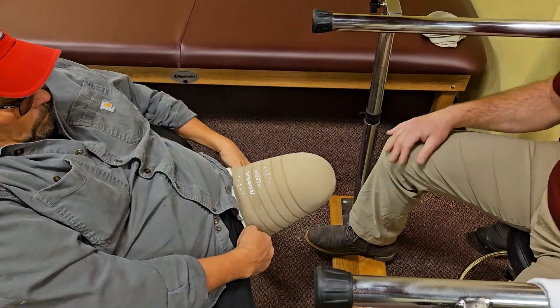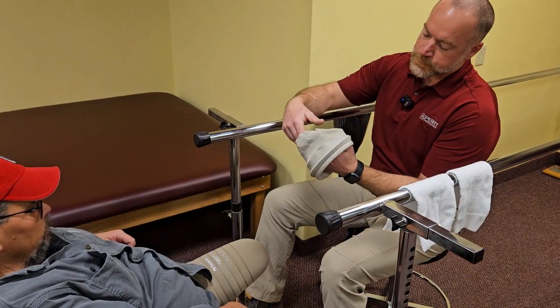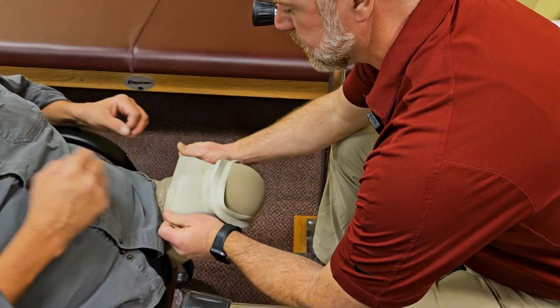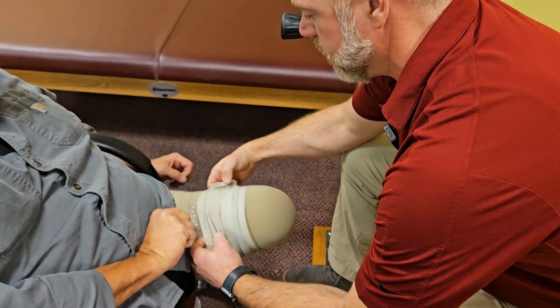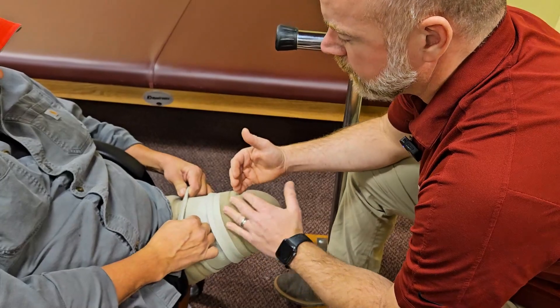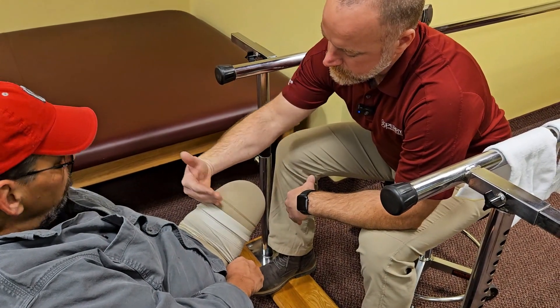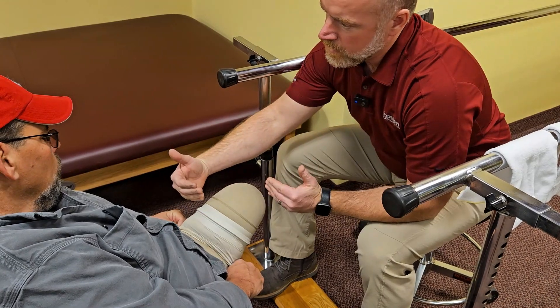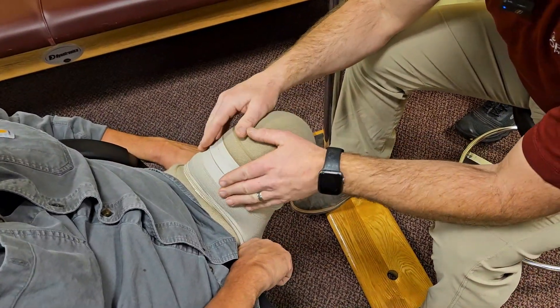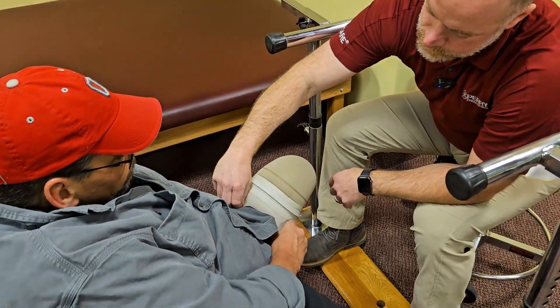So we have the seal-in ring. There's a little bit of fabric material that goes up, and the ring is down here — that's going to help hold the prosthesis on. With these movable rings, everybody is going to be a little different in how high or low it sits on the limb. Key points: keep it nice and level, not crooked or at an angle, and not wrinkled. You can see how it flips up and down — make sure it stays up, because if it's folded down the prosthesis is not going to stay on.